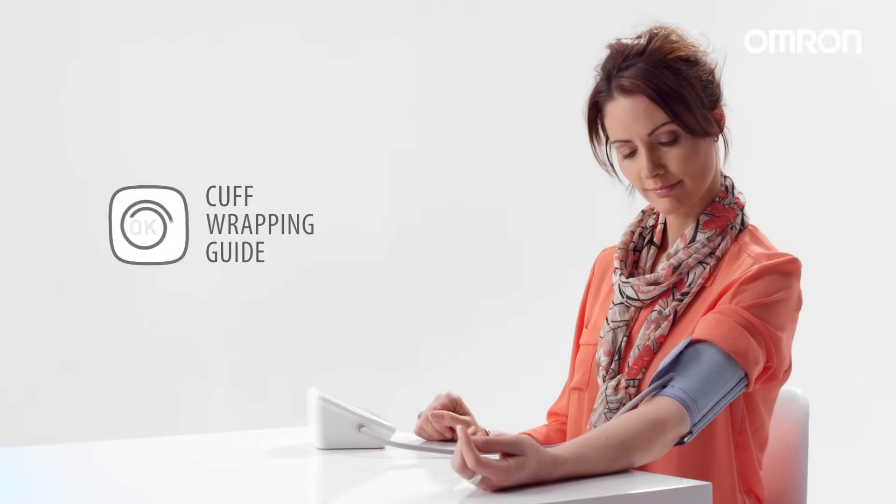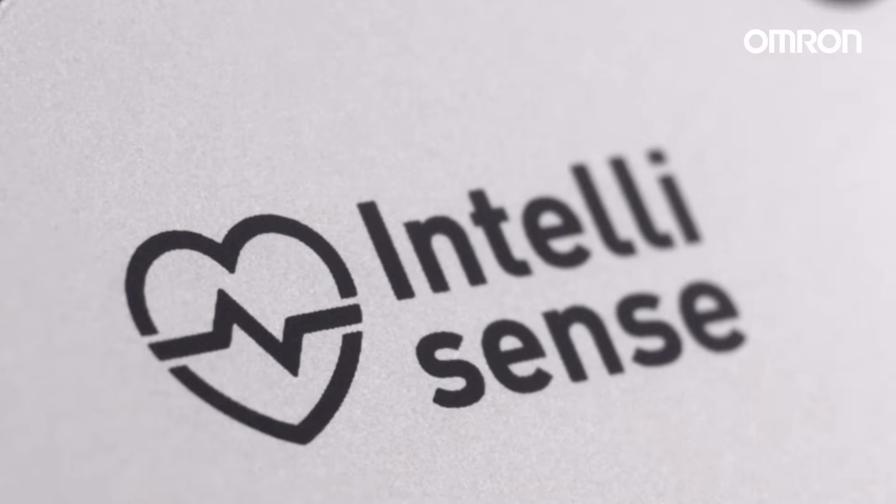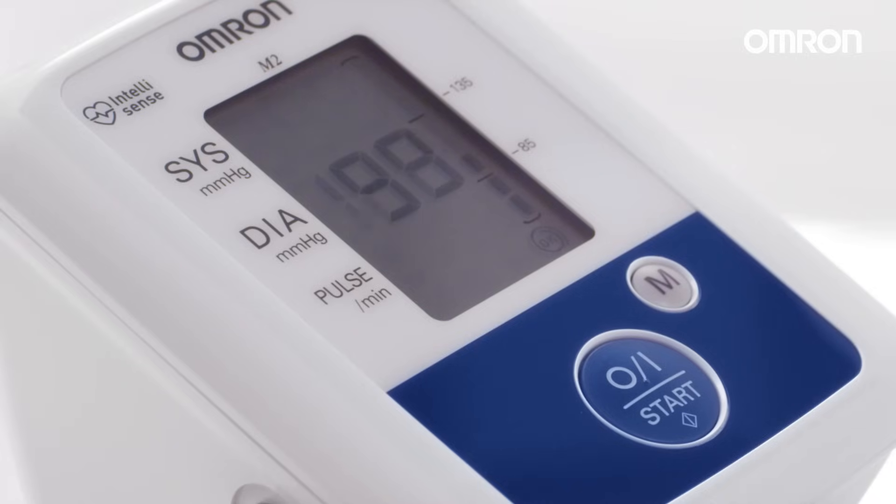The cuff wrapping guide automatically indicates if it's wrapped correctly. Our special sensors automatically monitor your heartbeat while your blood pressure is being measured.